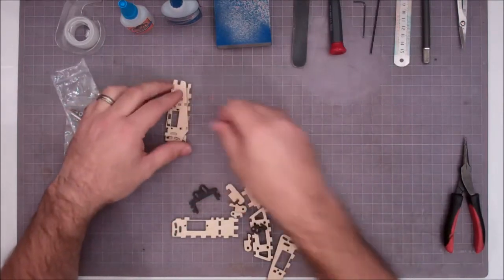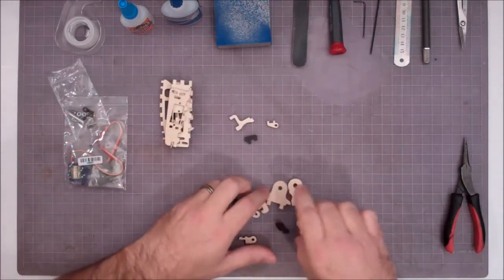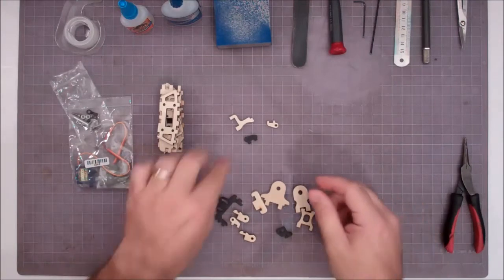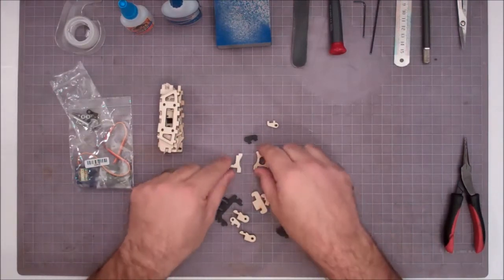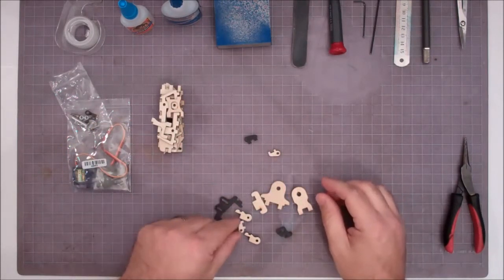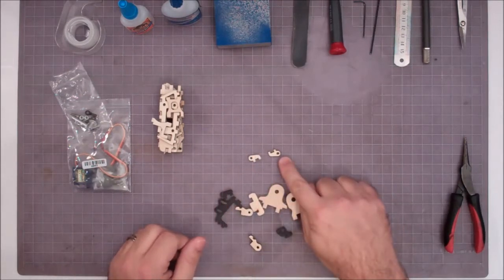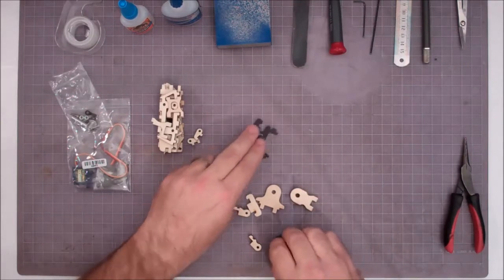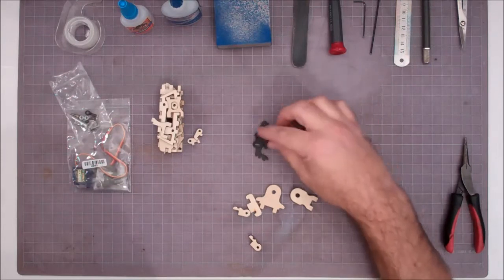First off are all your flat plates here. These large flat plates all are parts of the palm. Along with the bigger plates are these 2 little L and H beams. Those go aside. And then the 2 small wooden tabs here, those go over there too. The black parts go together. These are going to be the wishbone that carries the thumb.